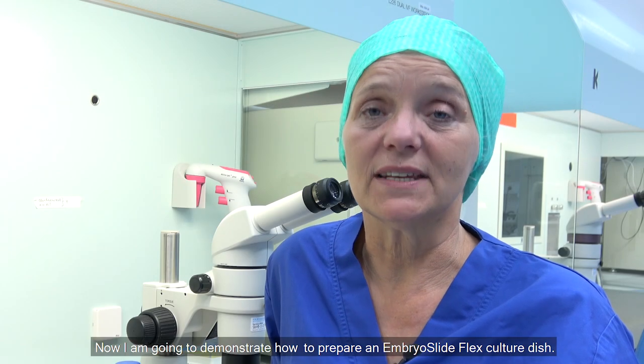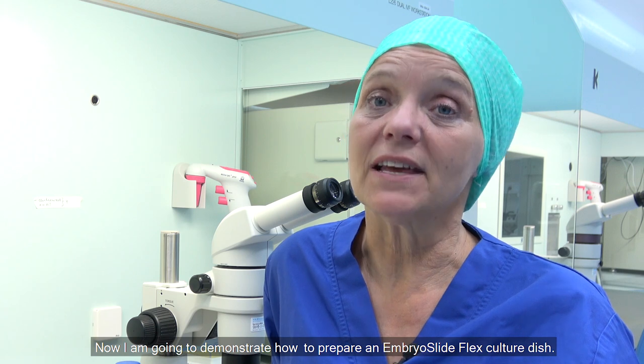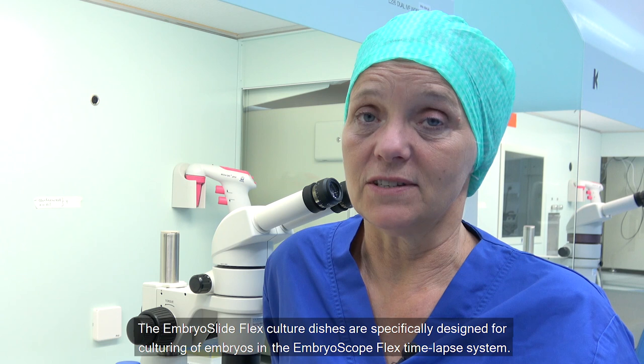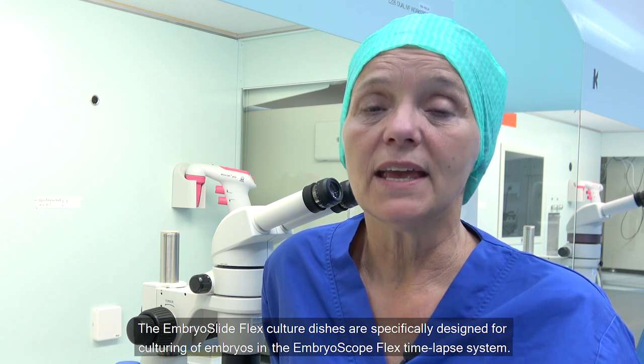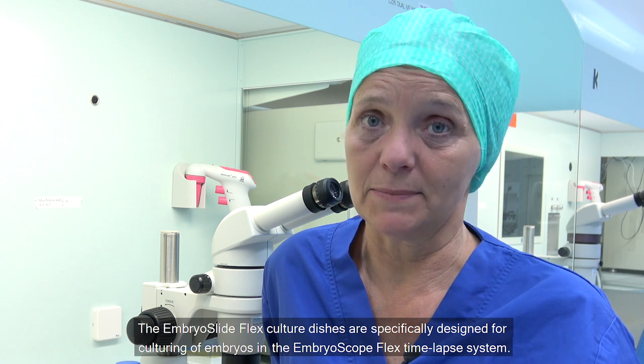Now I'm going to demonstrate how to prepare EmbrooSlide Flex culture dishes. EmbrooSlide Flex culture dishes are specifically designed for culturing of embryos in the EmbrooScope Flex time-lapse system.